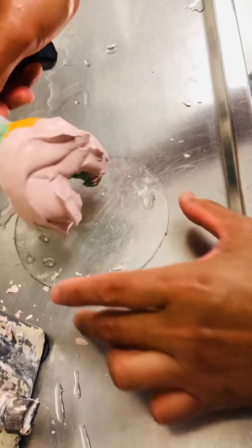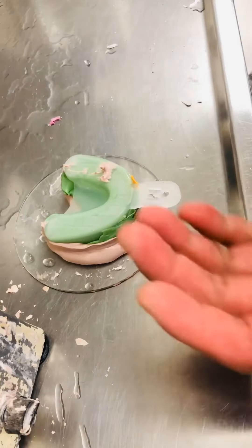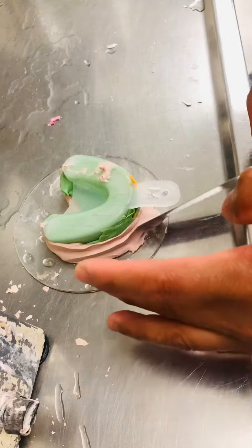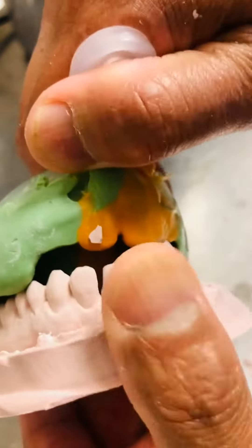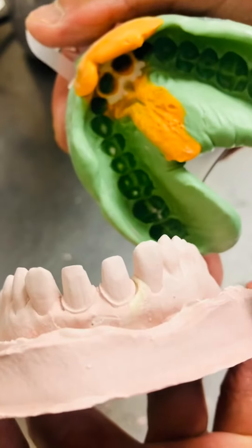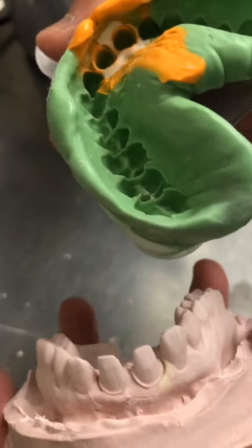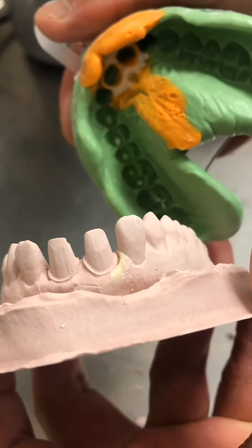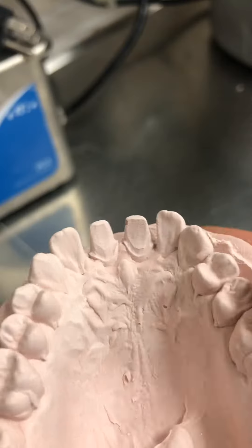I inverted it and let it sit just like that while I wait for it to set. Once it's set, you can see how clear and clean it is — you can see the margin right there. The wax is still attached to the impression, and that's it.